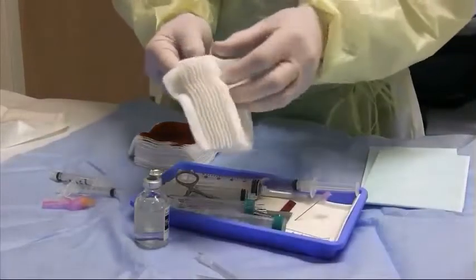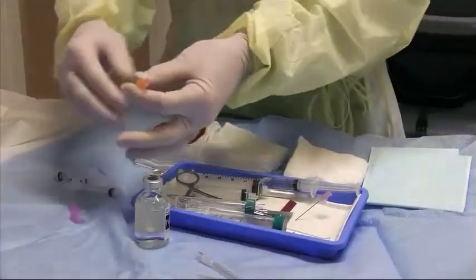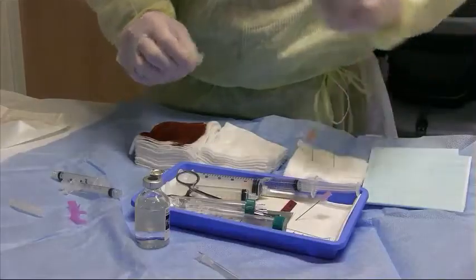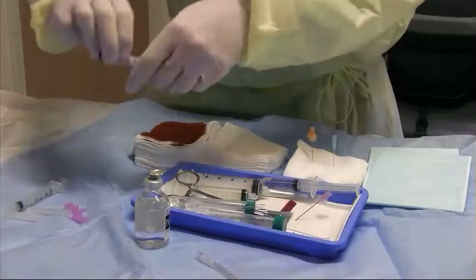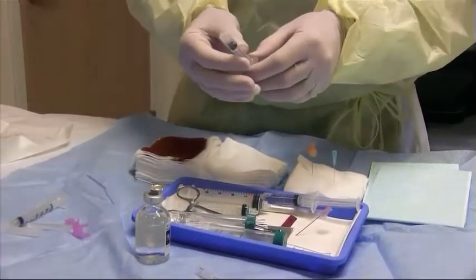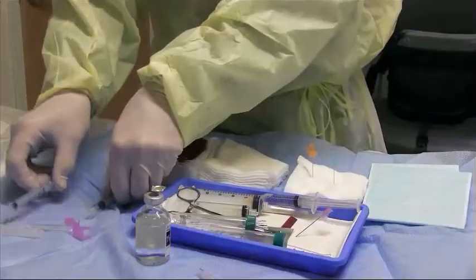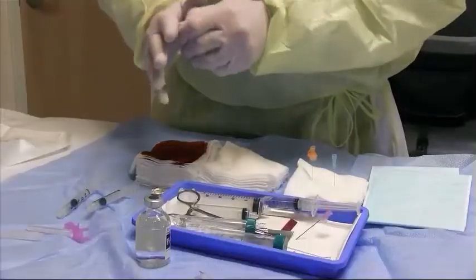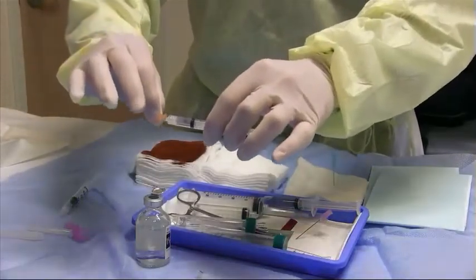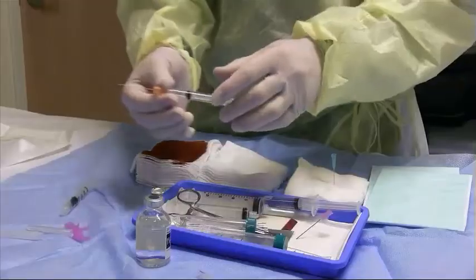Carefully take the needle off the syringe. We usually use either a 22 gauge or more commonly a 25 gauge needle to numb the patient, and set this aside. The way I like to set up the remainder of the tray — each attending is different — I divide up and lay out my needles beforehand so I can easily grab them during the biopsy, placing them into the four by fours. I also pre-position the syringes with a little air so that after performing the biopsy I can just reach over, attach them, and hand off to the cytopathology technologist who makes slides.